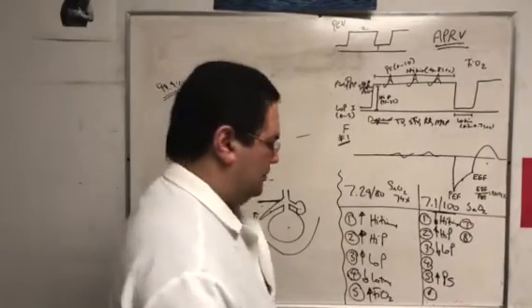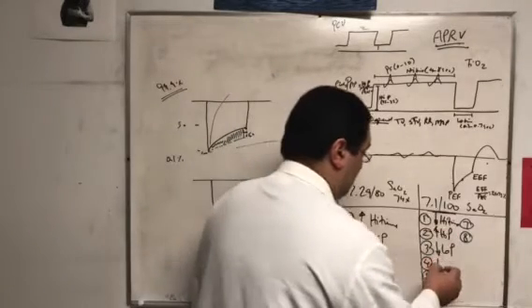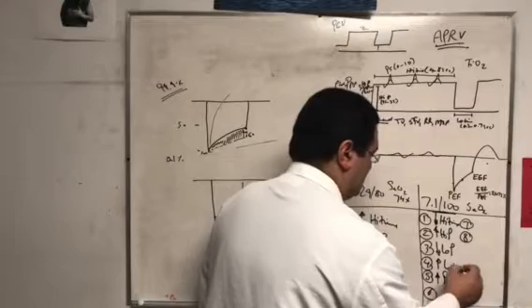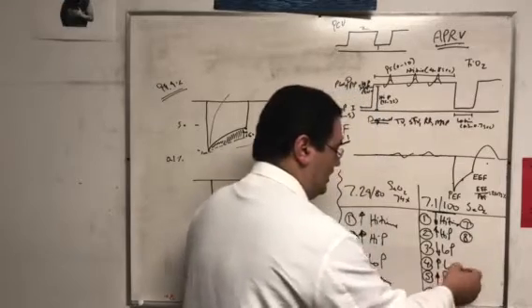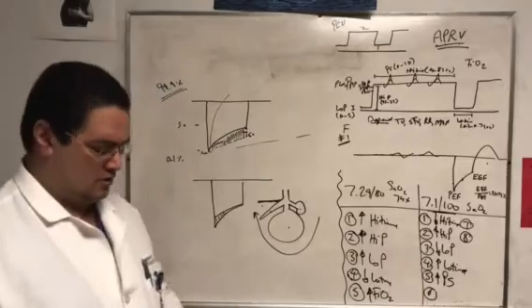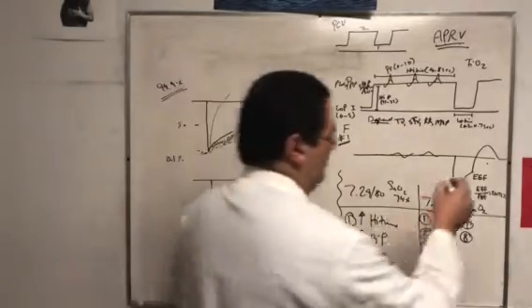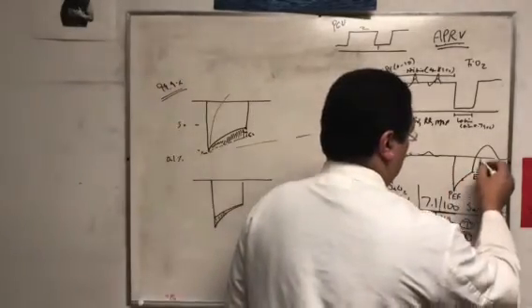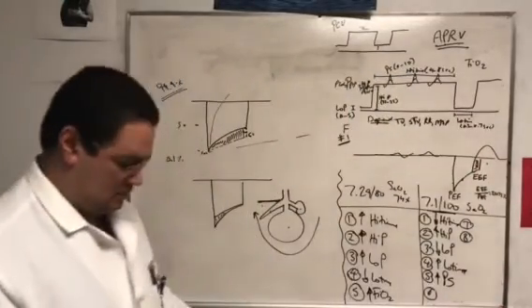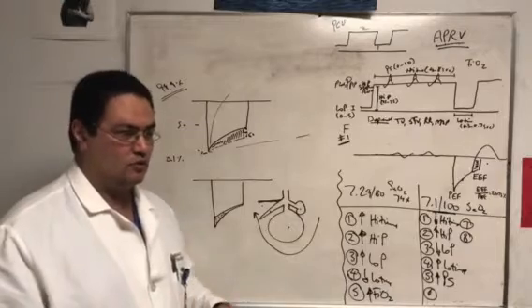What else? I'm going to say, increase or prolong the low time. This is the most guaranteed way to improve the ventilation. But why is it number 4? Because you can see, by going from here to here, this area is additional area under the curve. That's it. There's no debate. You will improve the tidal volume, no question about it.